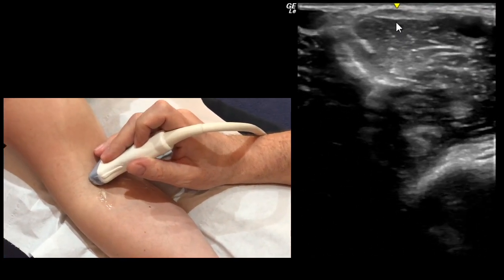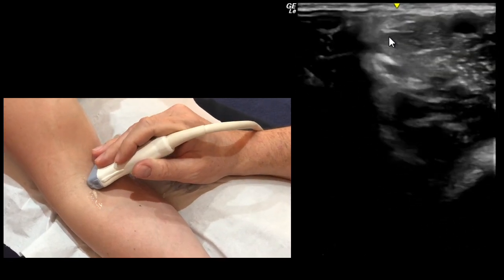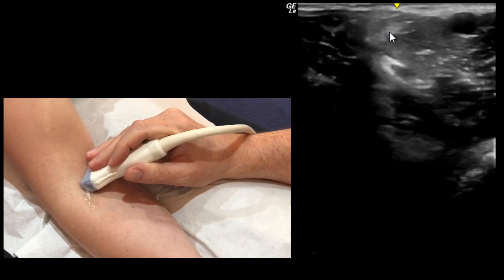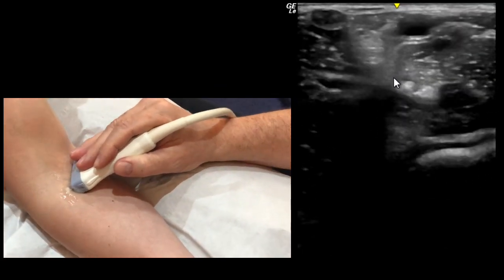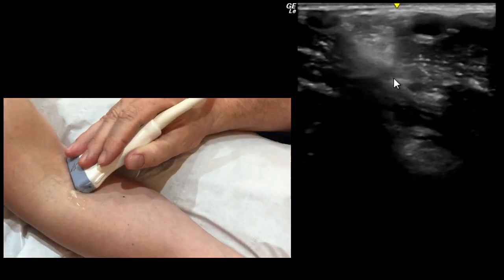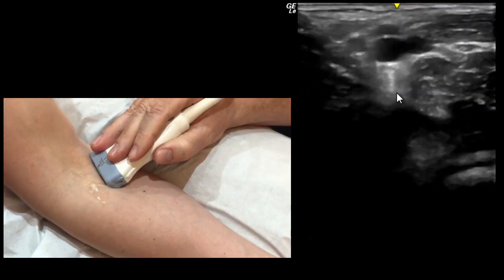Just as we get to the crease of the elbow the tendon will start descending. At this point you have to roll the probe round — keeping it in short axis but moving round medially — and the tendon descends here. Try not to lose it. You'll see the artery passing over the top of it.